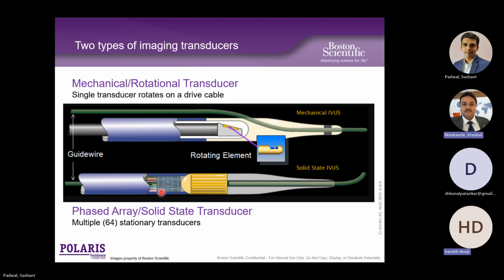So I'm not saying just because the image quality with our Boston IVUS catheter is better. I'm just talking about mechanical and phased array technologies. Agreed. Okay, so that's how these modalities are evolving. And if solid state transducer would have been that promising, in fact, all future technologies would move towards solid state transducer rather than solid state companies moving into the mechanical state.